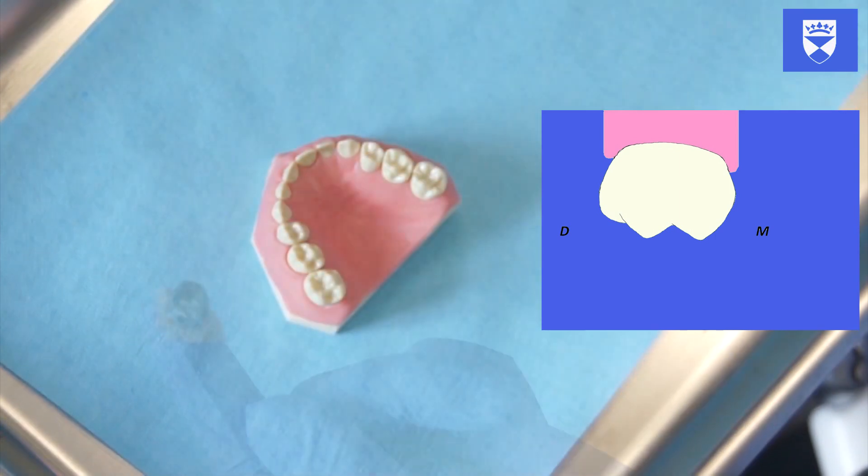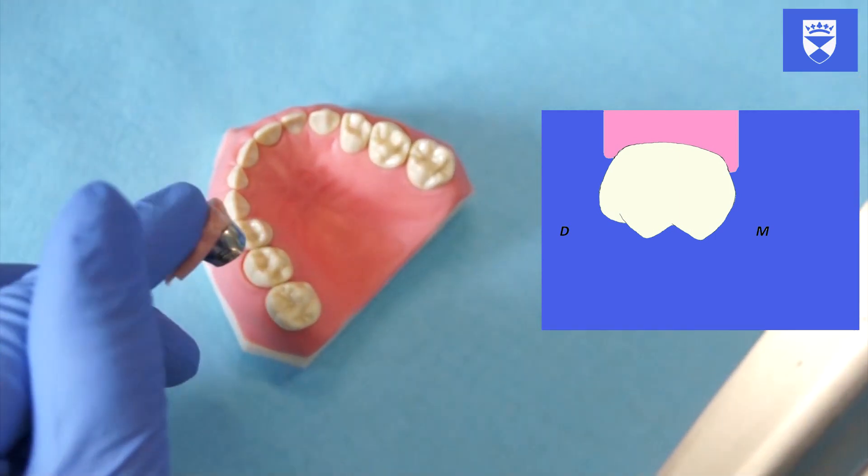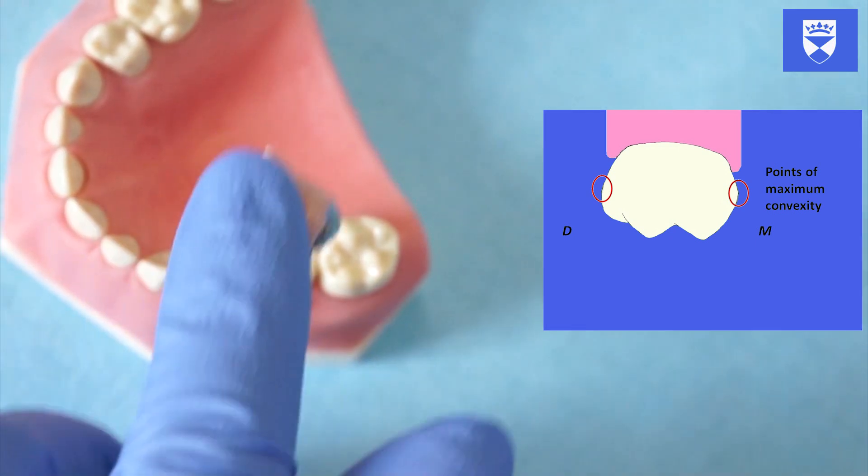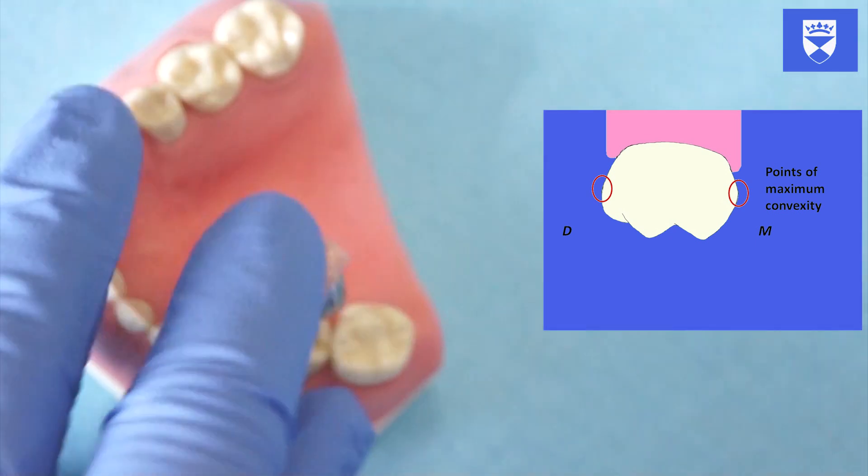Try the crown over the tooth. Ensure that the crown fits over the whole occlusal table but does not cover either of the adjacent teeth. Carefully determine the path of insertion.